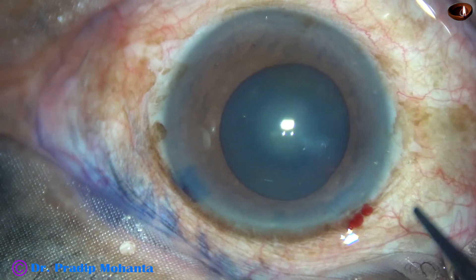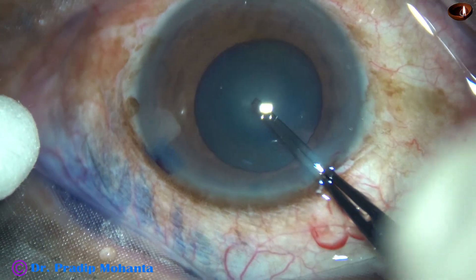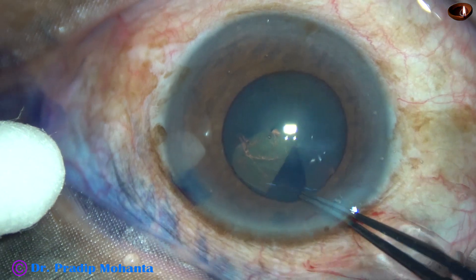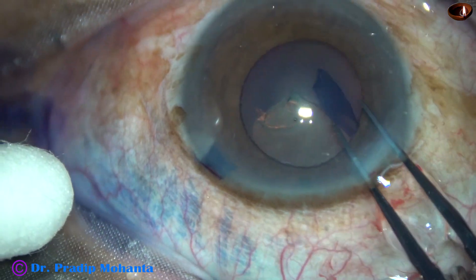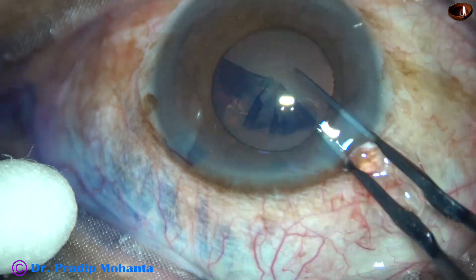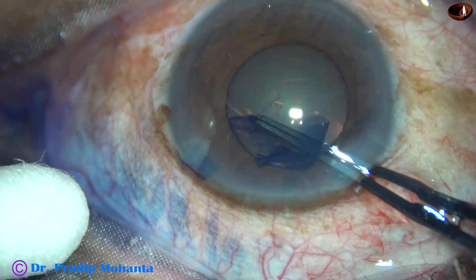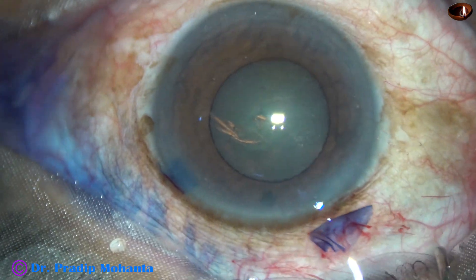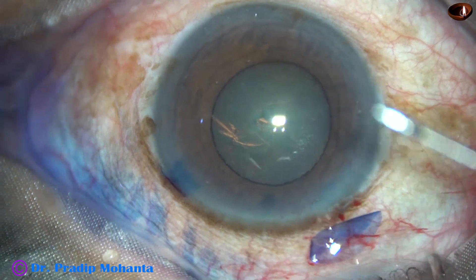Size of the pupil is about 4.75 mm and now I'm going to do a capsulorhexis. The capsule goes along the margin of the pupil and in some places beyond the pupillary margin, so that I get an adequate size rhexis of about 5 mm.